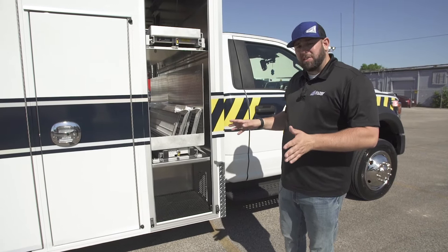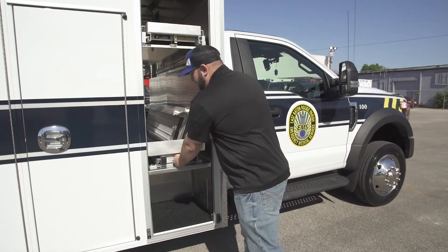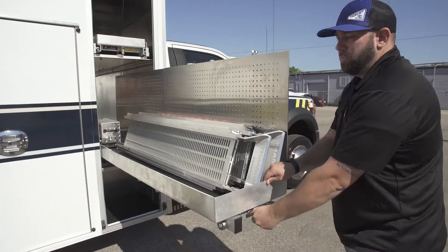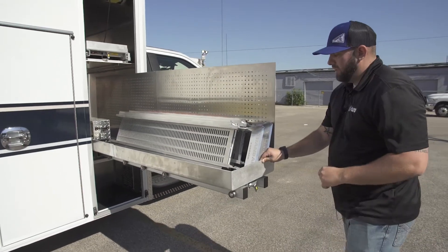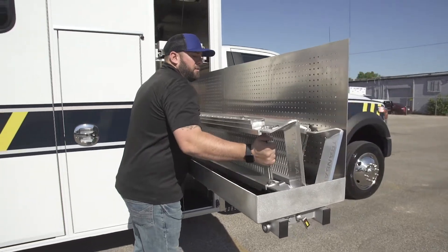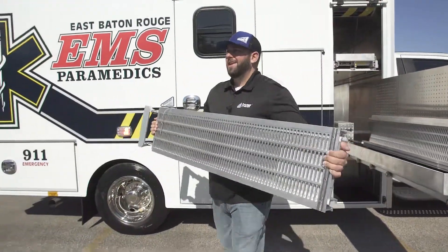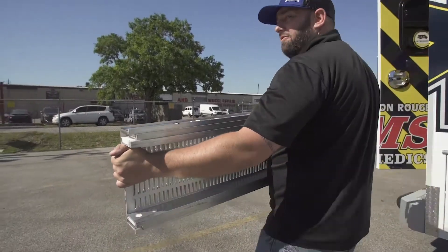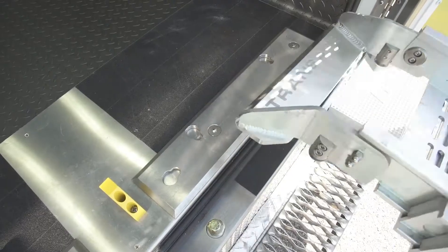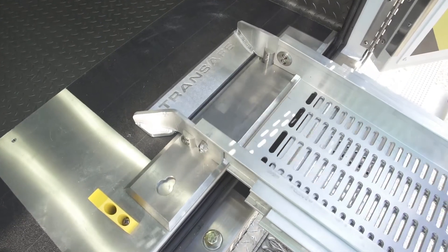To install the ramps is a very simple process. Slide the slide master out towards the passenger side until it stops — this makes it easy to access the ramp assembly. It's a one-person lift; this probably weighs 25-30 pounds. It's aluminum. The tab here has these keys on it, so it just sets into place and slides back.